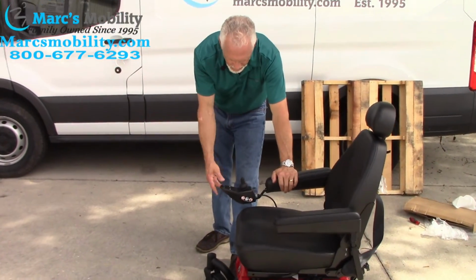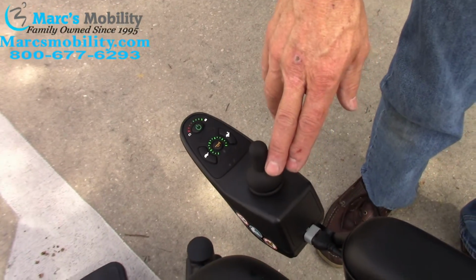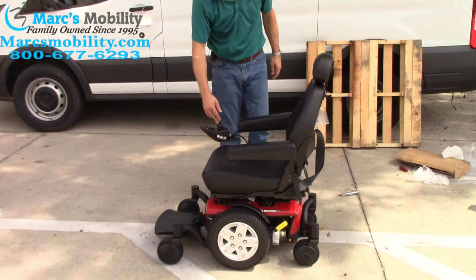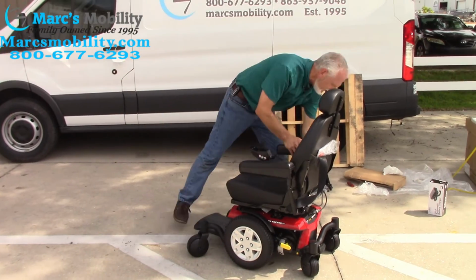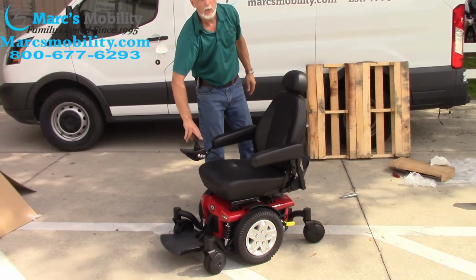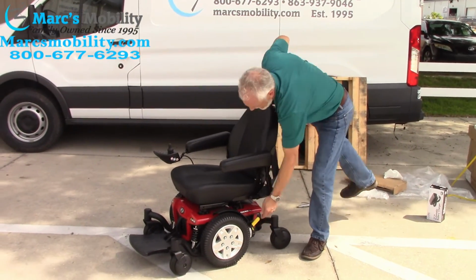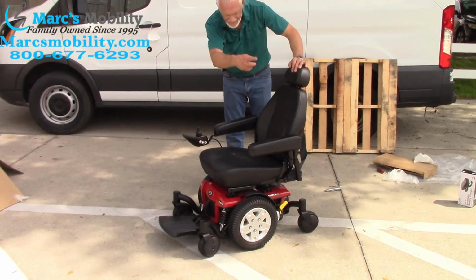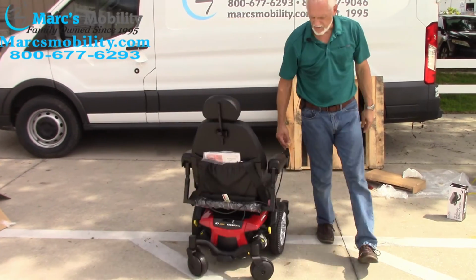So now we have power, and we can go forward and reverse. Remember, your neutral levers are right here. So if these are down, like that, you can roll the chair around, but it will not drive. So you have to turn the power off, put your levers back up, then turn the power on. It resets the whole computer, and now you're ready to go.